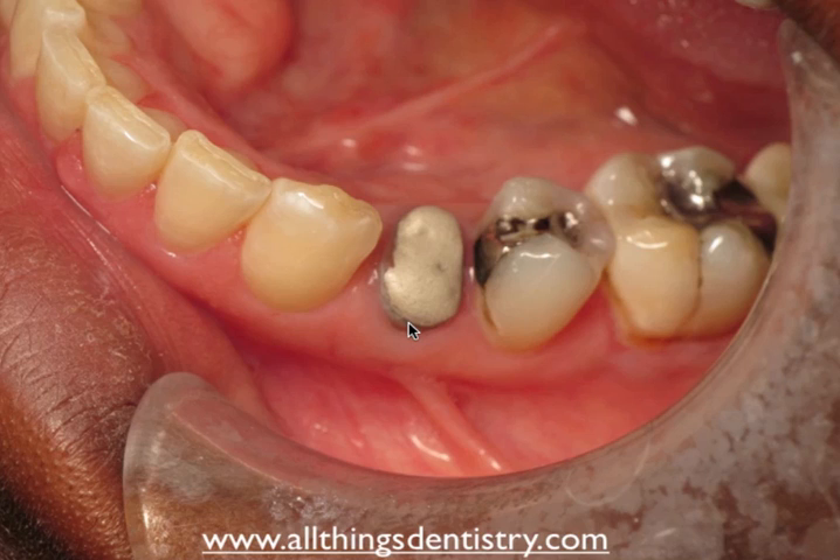So I'm going to assume the restorative dentist will place the finish line about 1.5 millimeters apical to the current margin. At that level, I need to obtain my biological width — 3 millimeters between the osseous crest and the most apical portion of the finish line. In my experience: go more or go home, especially with crown lengthening. There's nothing worse than not having sufficient biological width when you try to take an impression after the procedure.